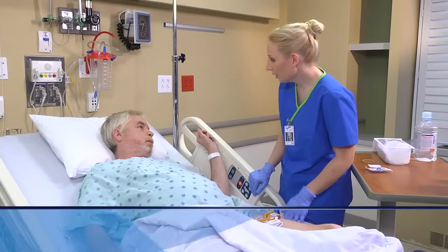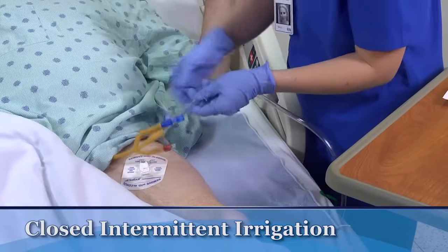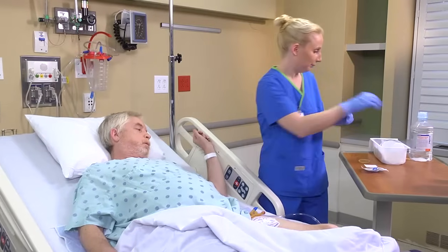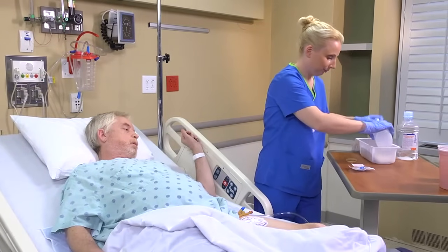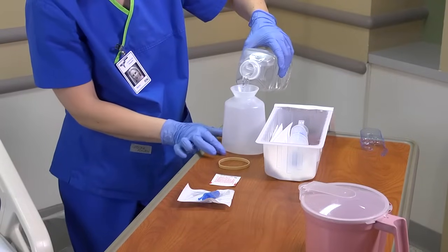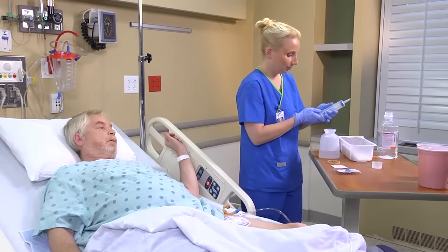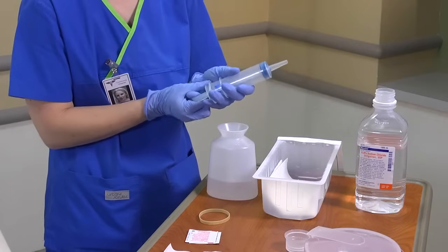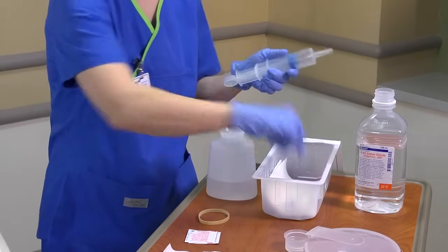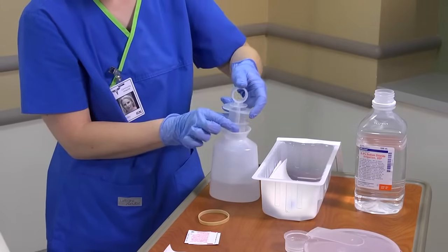I'm going to go ahead and irrigate your catheter. Are you doing okay? For a closed, intermittent irrigation, you'll begin by pouring the prescribed amount of sterile irrigating solution into a sterile container. Continue to use aseptic technique as you draw the prescribed volume of irrigant, usually 30 to 50 milliliters, into a needleless irrigation syringe. Then replace the sterile cap on the tip of the syringe.